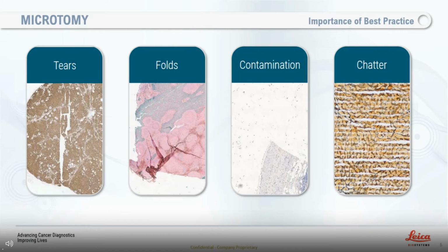The very same is true for folds within tissue. Even looking at the example that we have here, that tissue is going to be 2, 3, maybe 4 times deeper in this folded region that you can see. And again, that's going to lead to out of focus regions or the necessity to then acquire in Z-stacks.